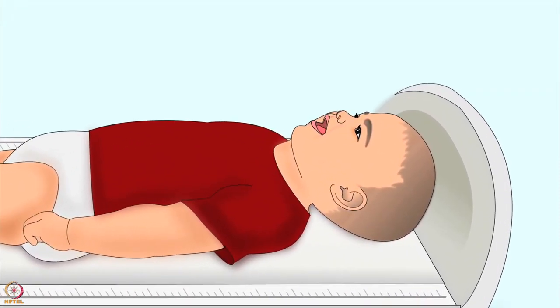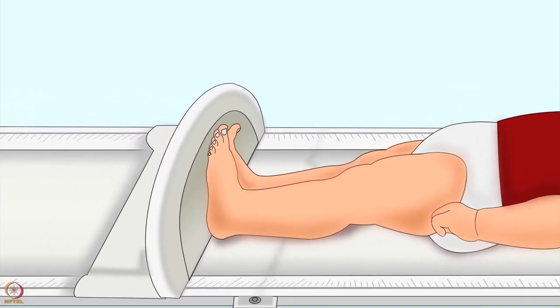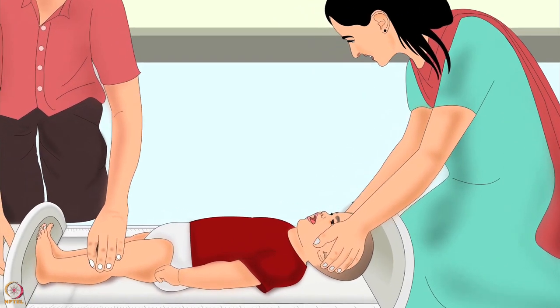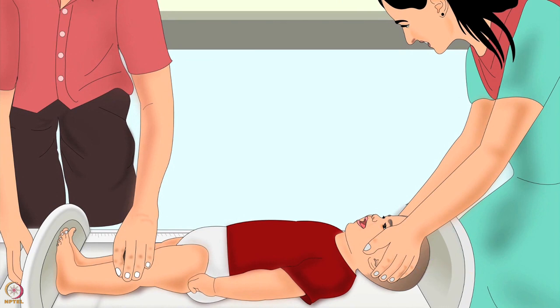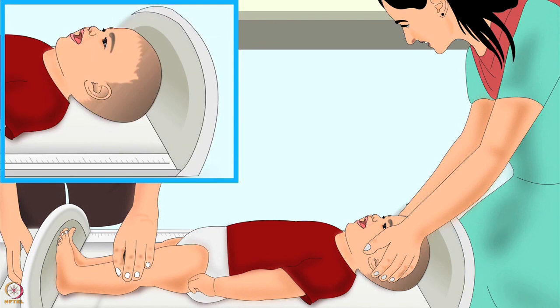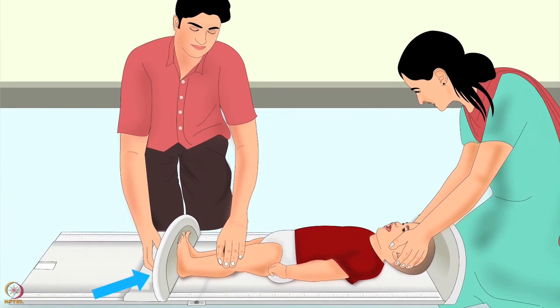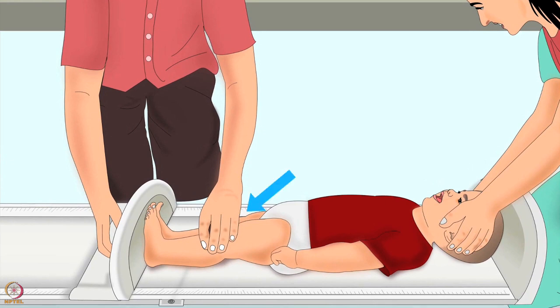The child's head should touch the fixed board end, and the child's feet should be towards the movable foot piece. One person should sit on her knees straight behind the fixed board, place her hands over the child's ears, and hold the child's head firmly. In this position the child should be looking straight up, and the top of the child's head should touch the fixed board. The second person should sit on his knees near the foot piece and straighten the child's legs, holding the child's knees firmly on the board with one hand.